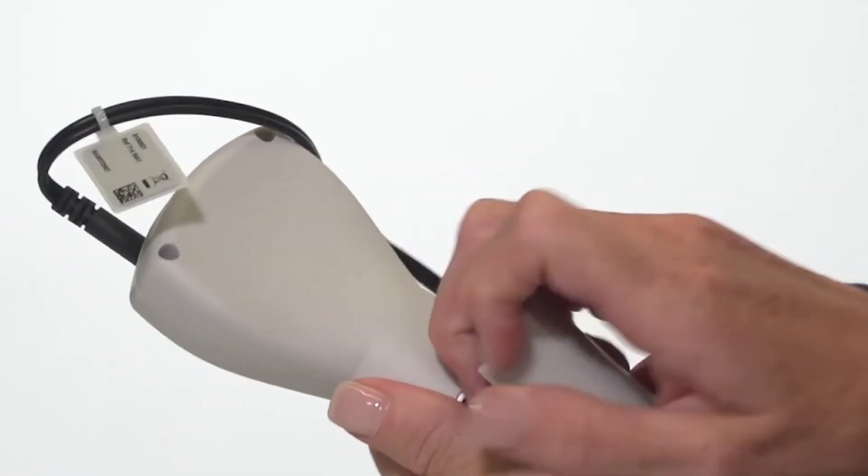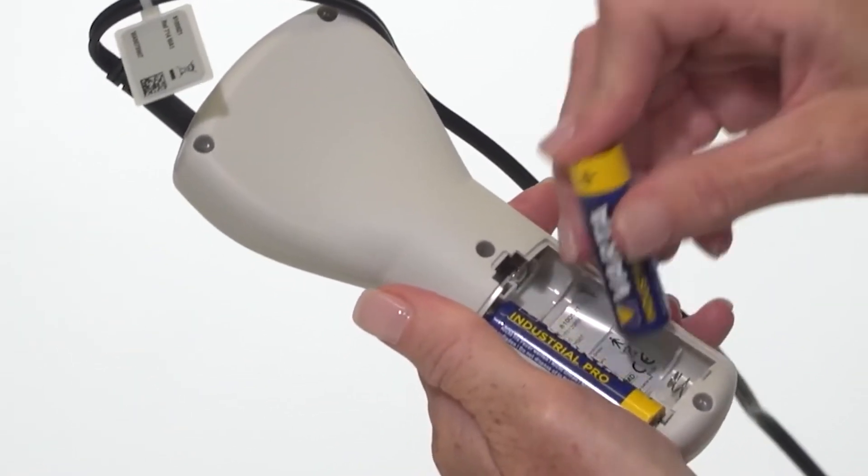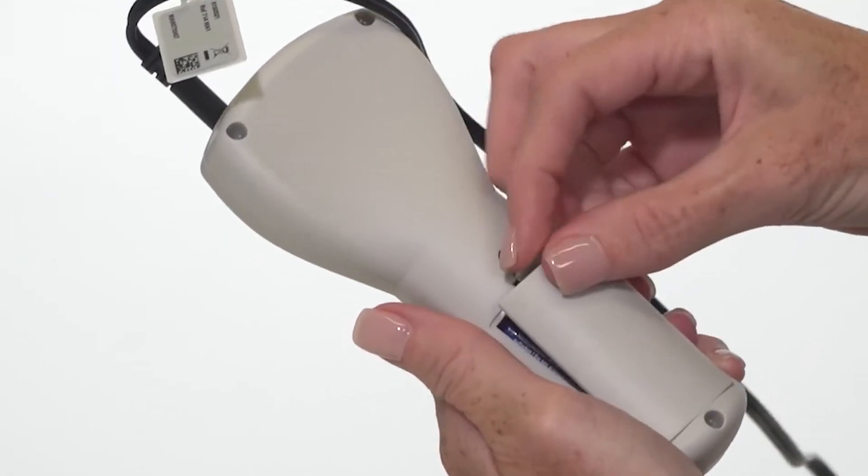Open the battery door to insert the two AA batteries, making sure the batteries are positioned correctly and completely seated before closing the battery door.